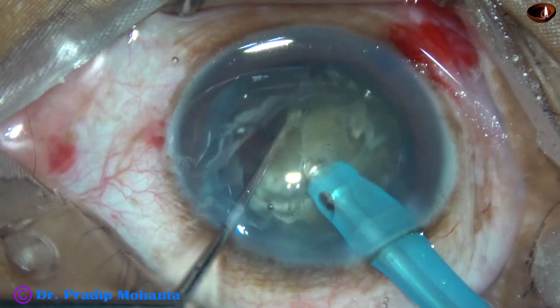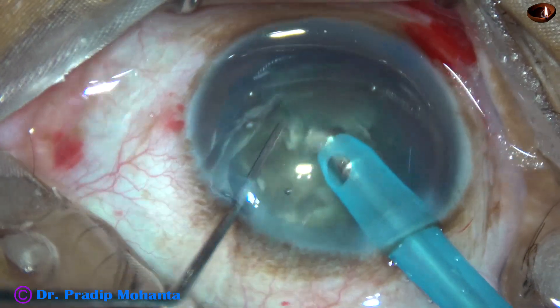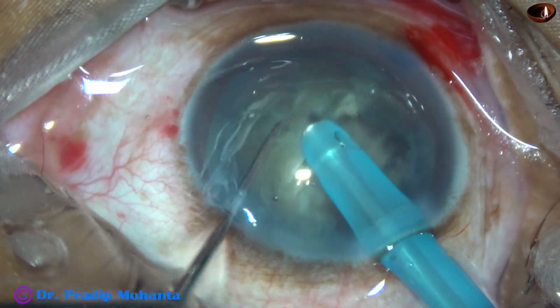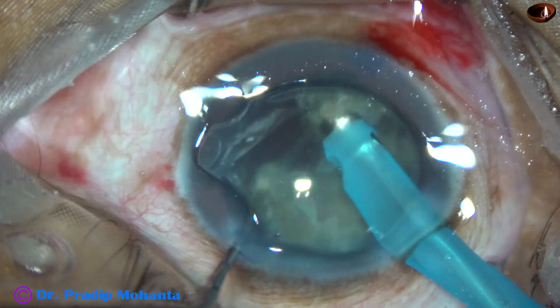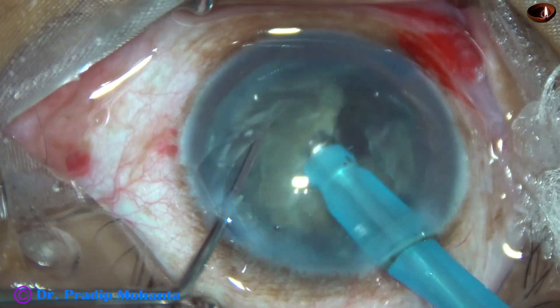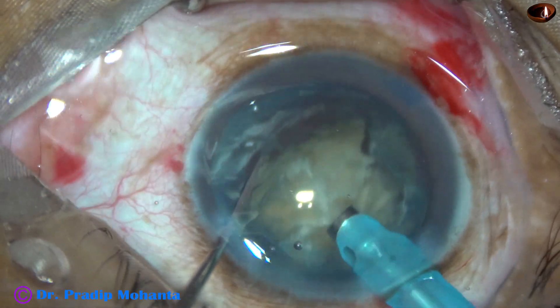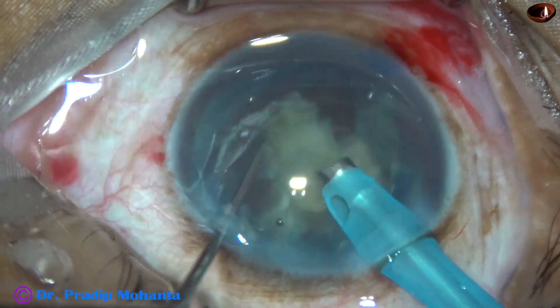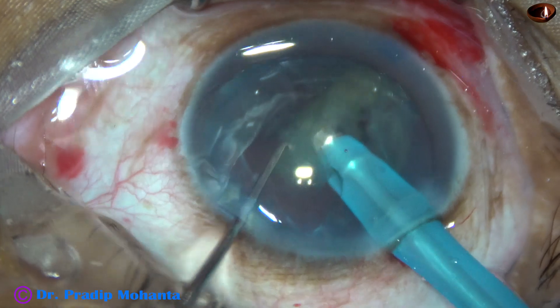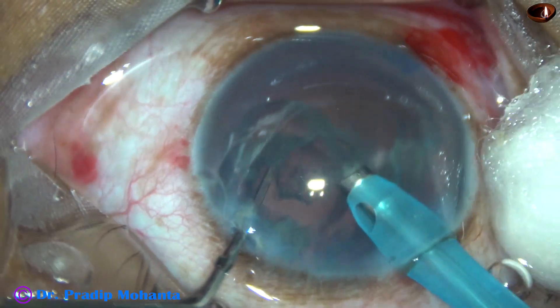Watch what I am doing. I am separating the epinucleus from the nucleus, so that the epinucleus cushion remains to protect the posterior capsule. Since the fluid over the cornea decreases visibility a lot, this is a safety measure we can take. The epinucleus is kept intact so that it forms a protective barrier for the posterior capsule.